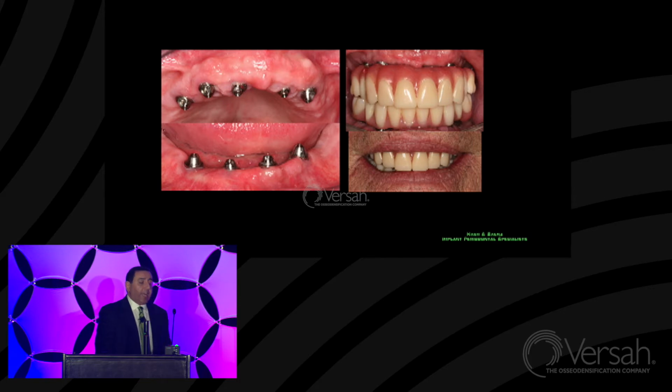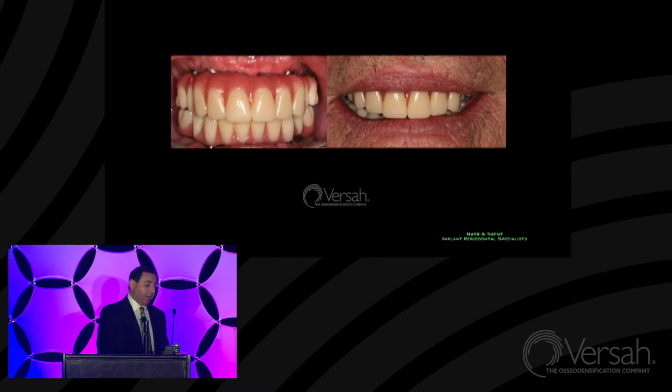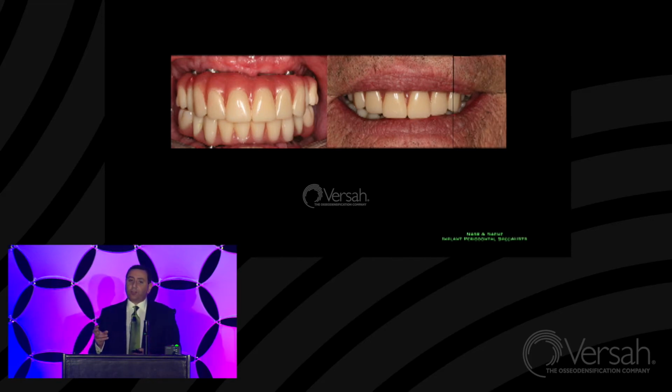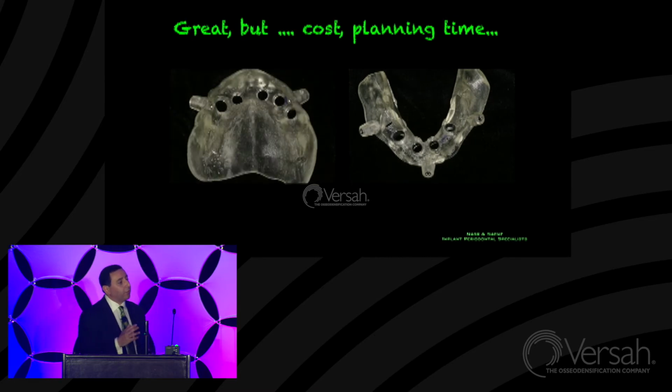So George was very happy with his final restoration, and so was I, and so was Dr. Finger. So it's great, but there is some cost in this procedure. There is a lot of time in the planning. While the surgical procedure is quite short, it took 47 minutes from start to finish for doing both arches, and this is while being careful, but we spent days in the planning.